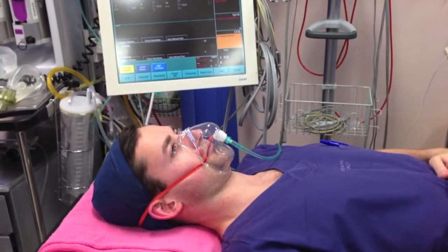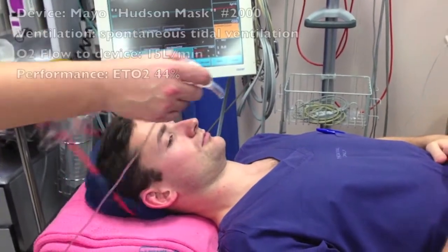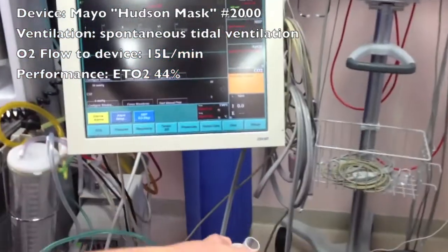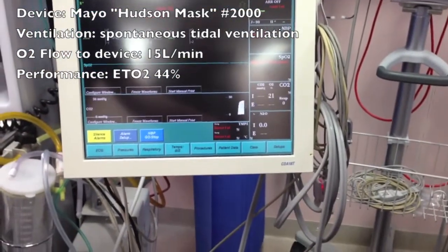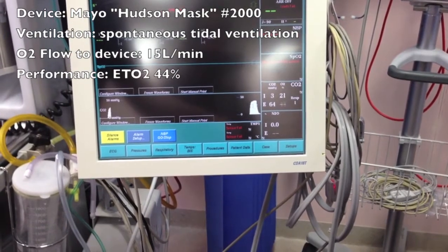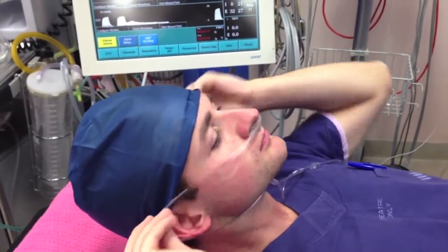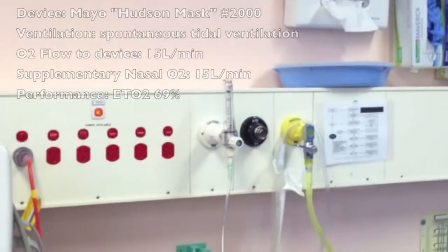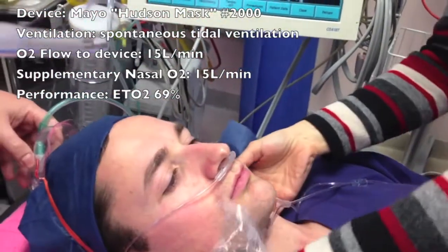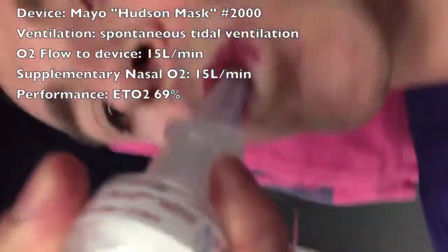Demonstration of the standard Mayo Hudson style mask following a 3-minute period of pre-oxygenation produces an end-tidal oxygen measurement of 44%. This is roughly equivalent to the performance seen during spontaneous ventilation when bag valve mask devices which lack an expiratory port are used. Supplementation of the oxygen flow to the standard Hudson mask using nasal prongs attached to a second oxygen source at 15 litres per minute raises the end-tidal oxygen after a 3-minute period to 69%.